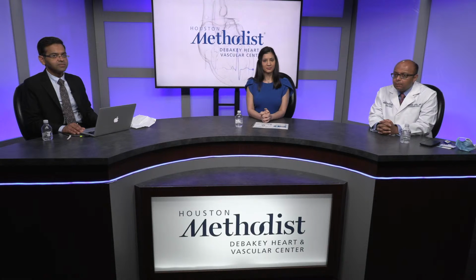And I think this case highlights the importance of multimodality imaging in teasing out which is the predominant lesion that needs to be treated in patients with multivalvular disease. As pointed out by Dr. Kleiman and Dr. Reardon and others, usually when patients have severe aortic stenosis and severe mitral regurgitation, the initial valve intervention of choice is transcatheter aortic valve replacement, followed by reevaluation of MR.